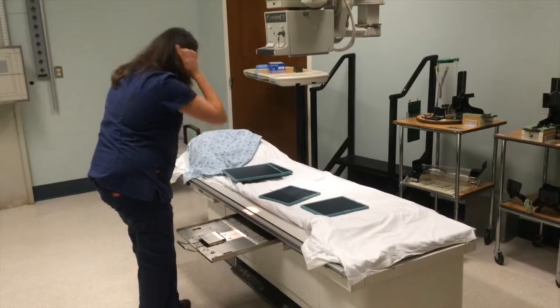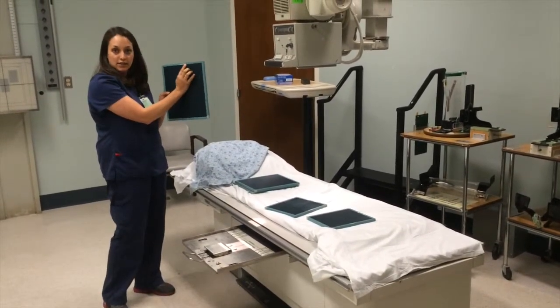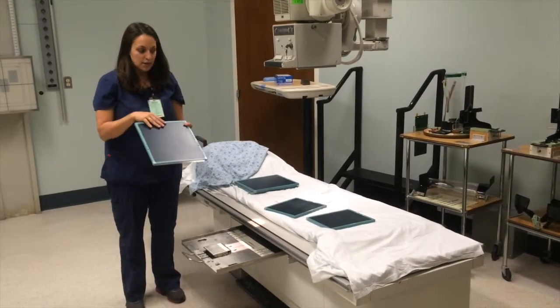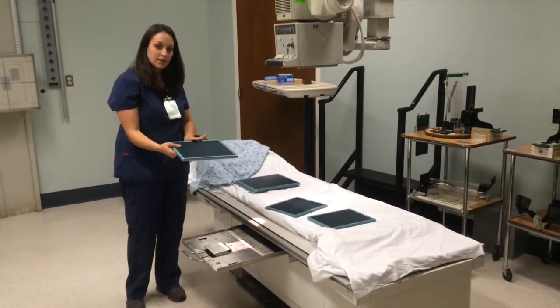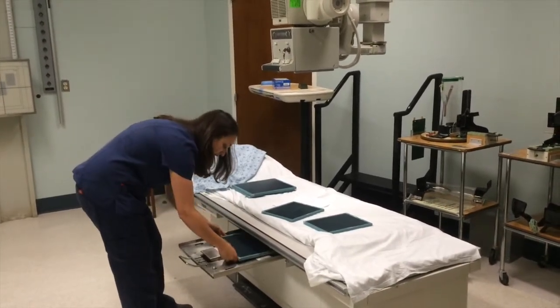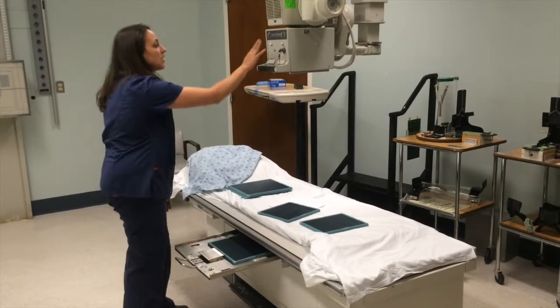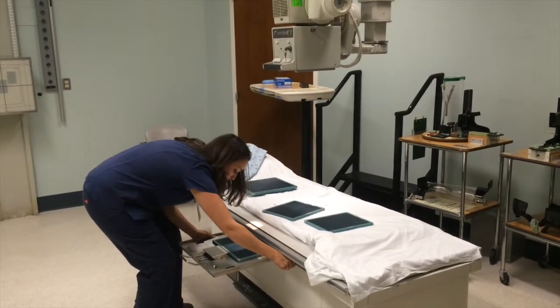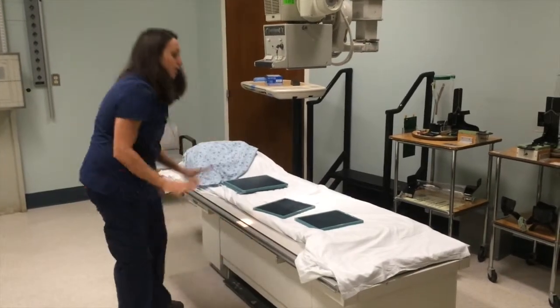So now that I have it open, I'm going to get ready to do my first view. This little line here shows that I'm going to do it portrait. So the patient's head is going to be on this side, so I'm going to point this in the patient's head direction. I'm going to slide this in and make sure it's nice and lined up. And then just to be on the safe side, I'm going to ensure that it's a straight line. Slide it right in. So now it's all ready for the first view.